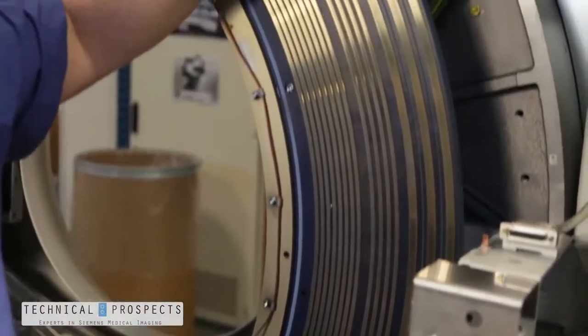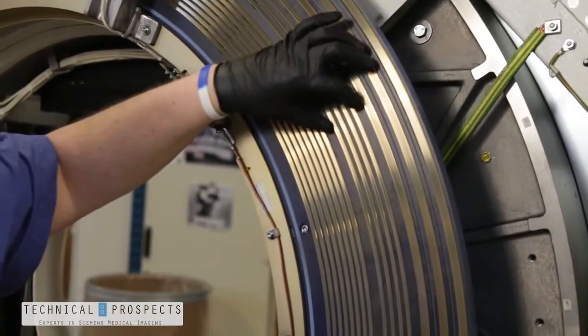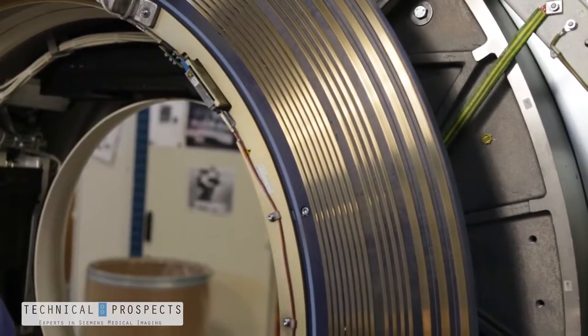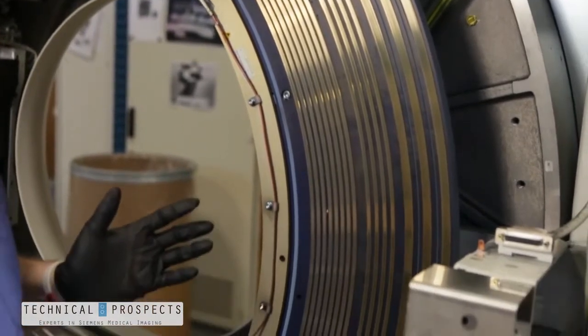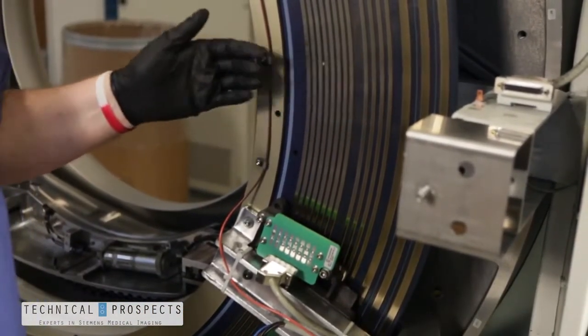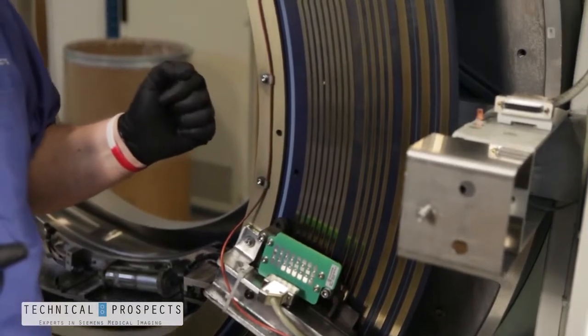We should be looking at our high voltage slip rings, our low voltage slip rings, and our data brush slip rings in this particular slip ring system. This happens to be a Siemens Sensation system, so we have this particular configuration. Your configuration may change based on your system.